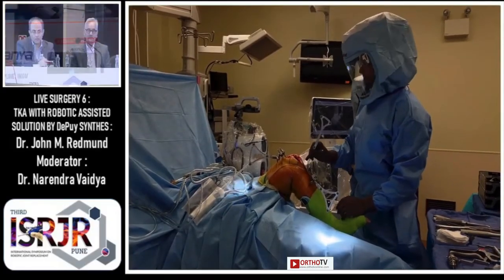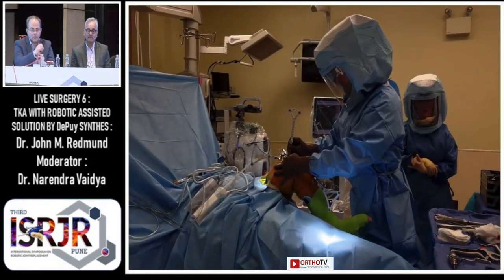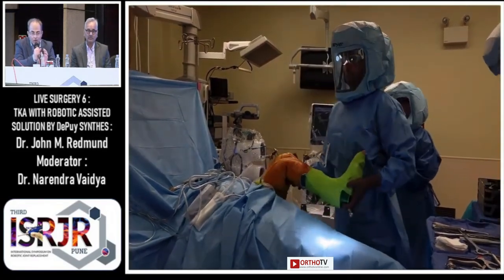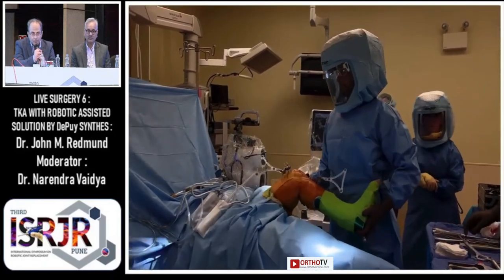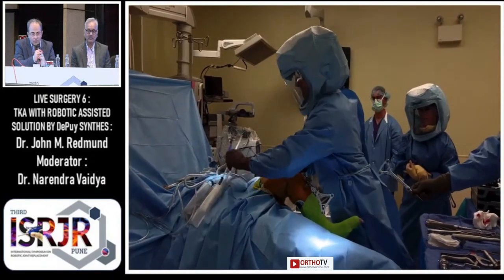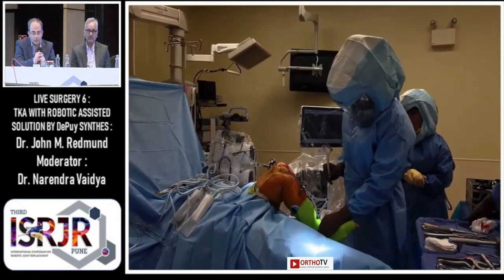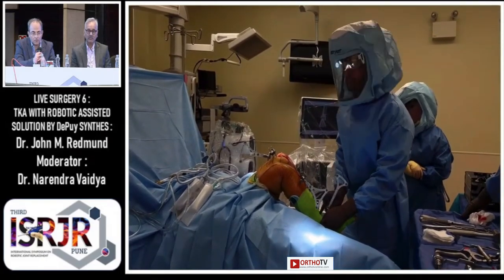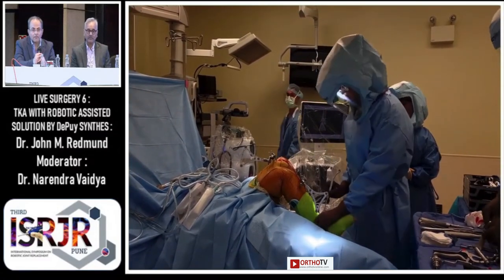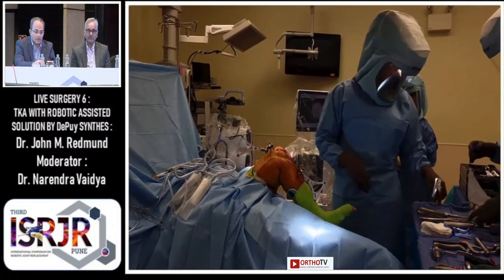This is the tibial checkpoint and that's the femoral checkpoint. These are not fixed points requiring pins — I put my tibial pins outside of the wound so I can still use the software program when I have the real implants in. I put a small hole in the tibia and use the femoral pin for a checkpoint on the femur. I just took the hip center, and right now I'm collecting the ankle center. The computer will calculate the midpoint between the malleoli for the distal aspect of the mechanical axis of the tibia.